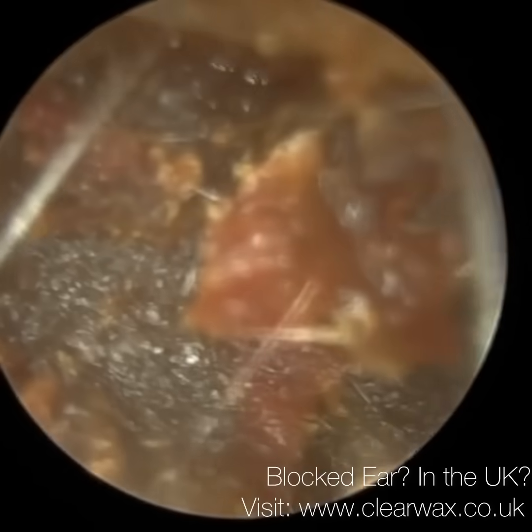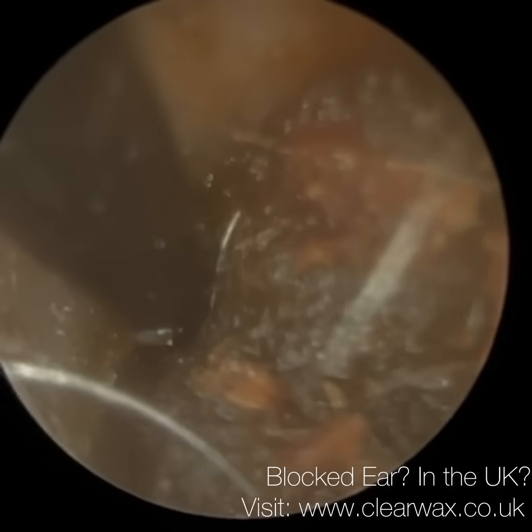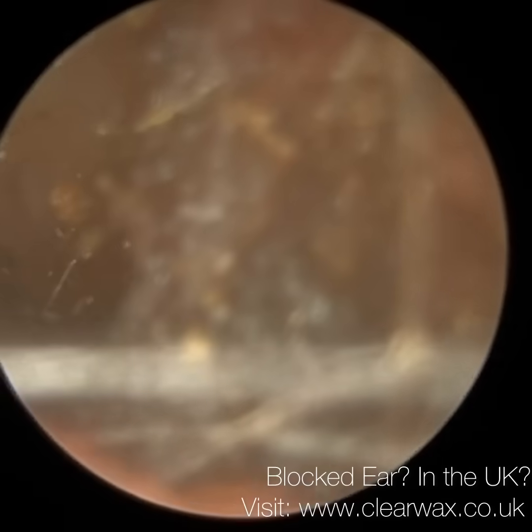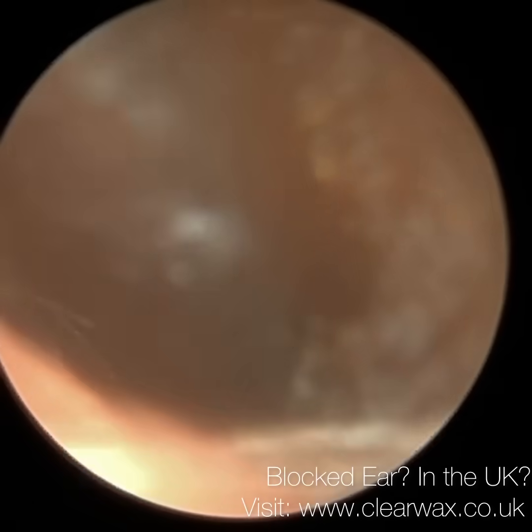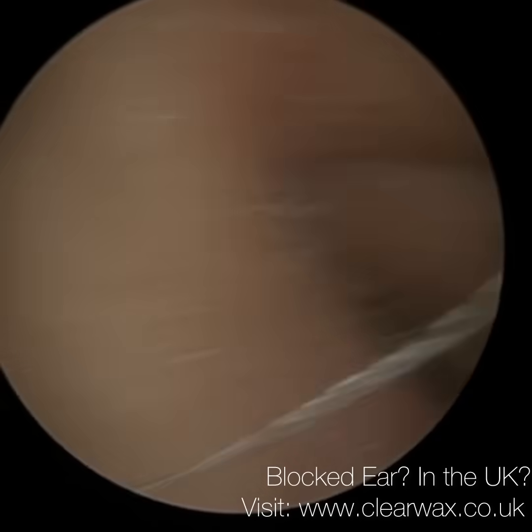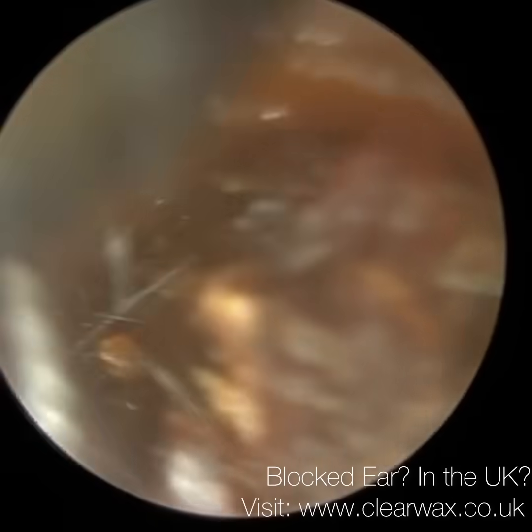Although there's not much opening there, because of the design of the right ear hook, I'm able to glide it right in between earwax that's up against the canal wall. It's got a streamlined profile, and it's got a tapered tip. But I think it's the Curette that I really need now.